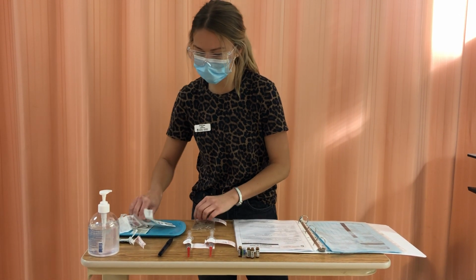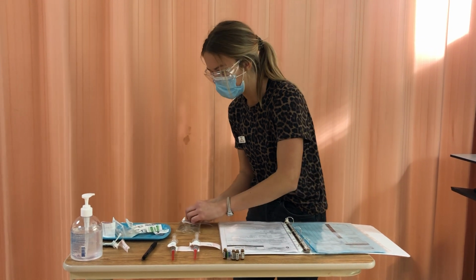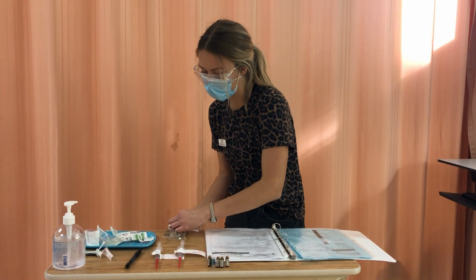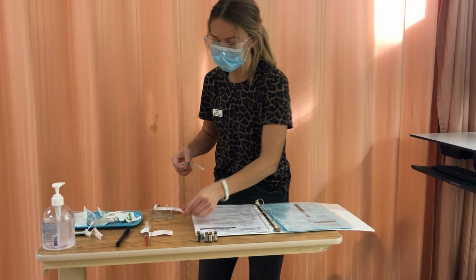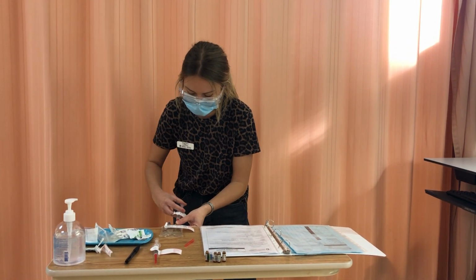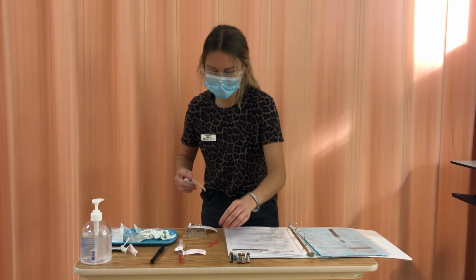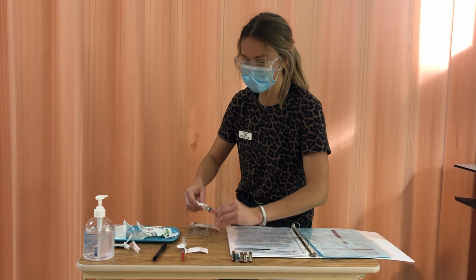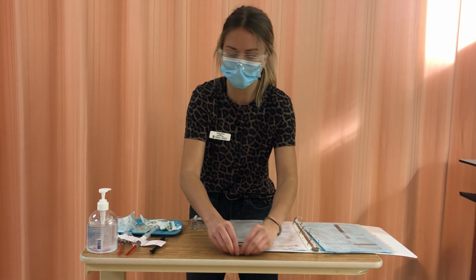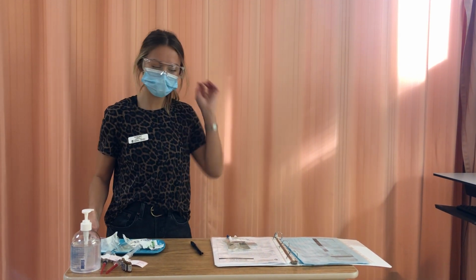So I will inject my morphine into my bag, and then I will head to the bedside for my final checks. So I'm swabbing again for 30, drying 15. I'm going to inject my 5 mLs into my bag. Withdrawing. And then I've been putting both of these into the sharps container and this into the med waste. The sharps, I guess, as well, because it's glass. And I'm just slowly doing this, and then I will head to the bedside with my second nurse.